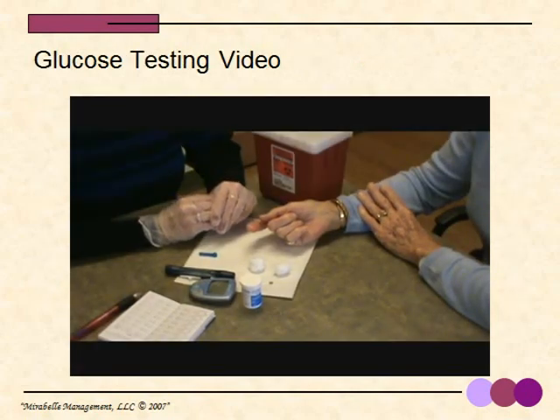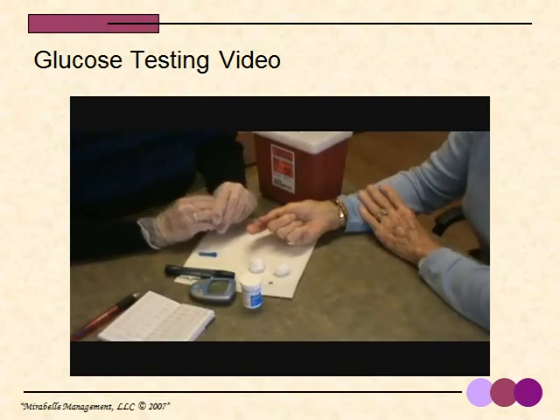Next, we will demonstrate the blood glucose testing. The first thing you need to do is communicate to the client what is going to happen. Hi, I'm Cheryl and I'm going to check your blood sugar today. Thank you, Cheryl. Next, gather all your supplies.